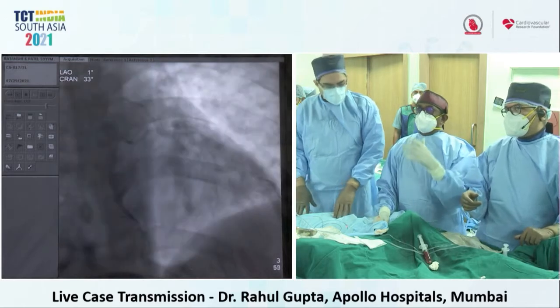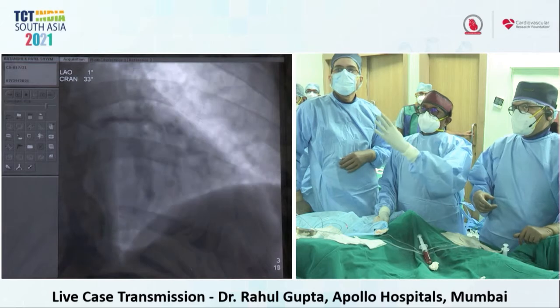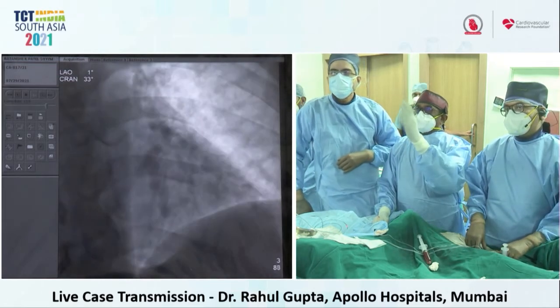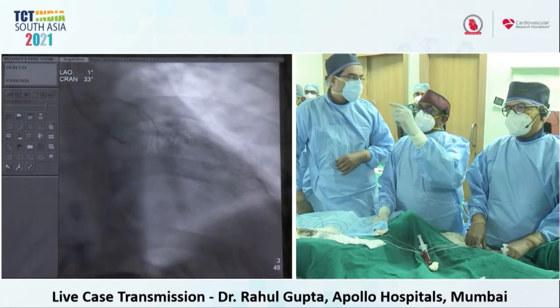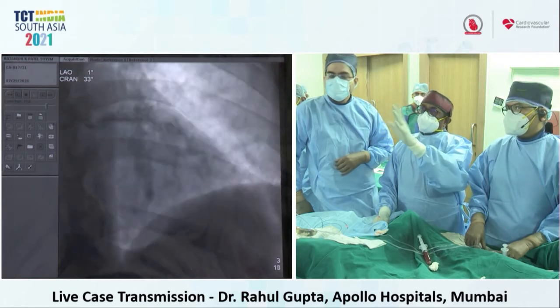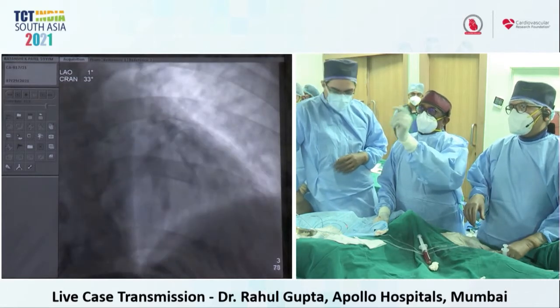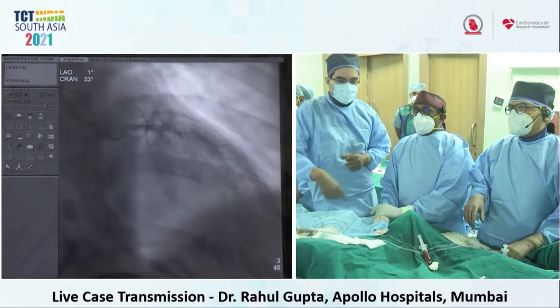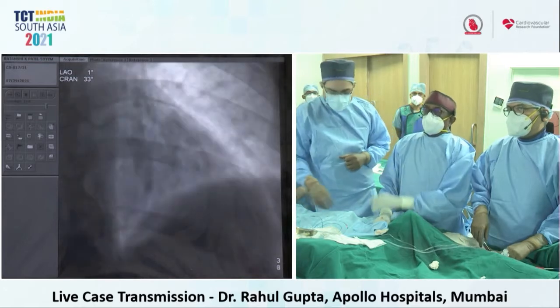Dr. Sengoto, if you look at the angiogram, it is a tapering LAD from soon after its origin. So I think we have to keep the diameter of the proximal LAD in mind. And if you look at the angiogram during the OCT, the mid LAD is quite good sized. There is probably much more disease in the origin of the diagonal and thereafter. So we will appropriately select a stent in a few seconds after looking at the diameter on the OCT.